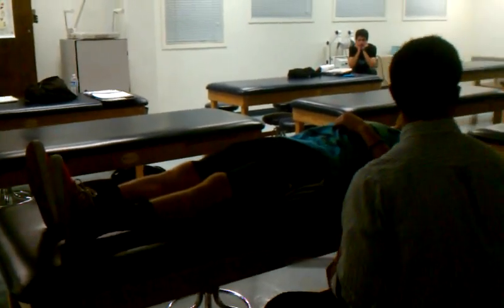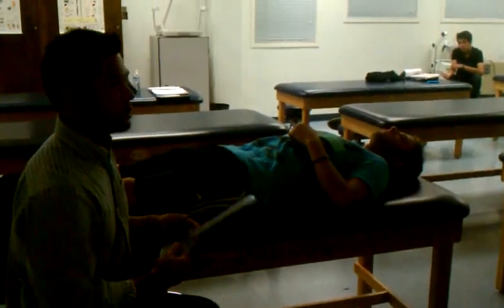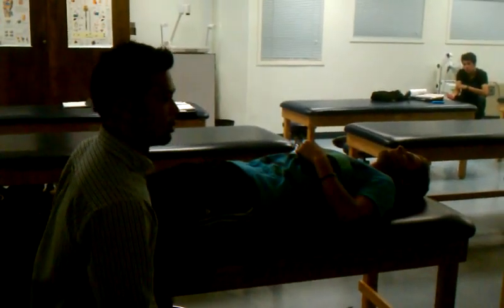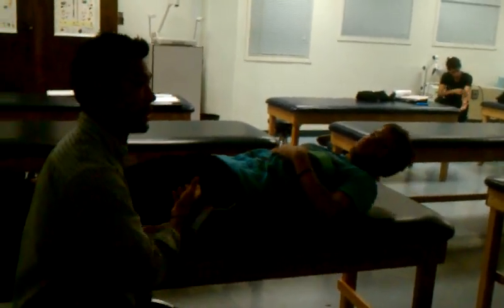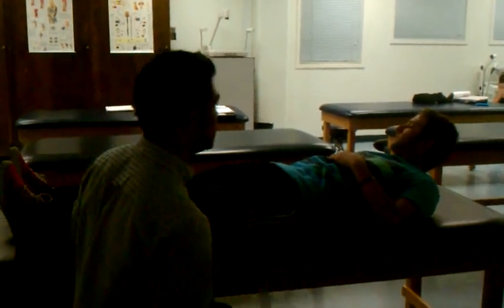Should you always measure the same way — like if you have flexion and extension, should you always do the same thing? Yes, always. When you're doing range of motion for any joint, they're going to be coming back from surgery or similar, so there would be no purpose otherwise — unless you're establishing baseline measurements.